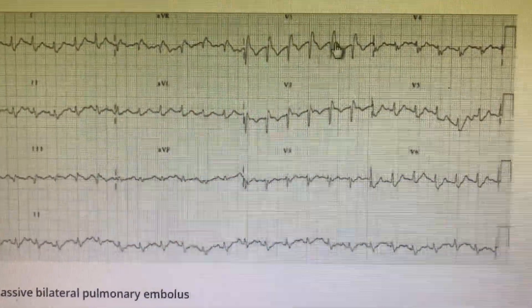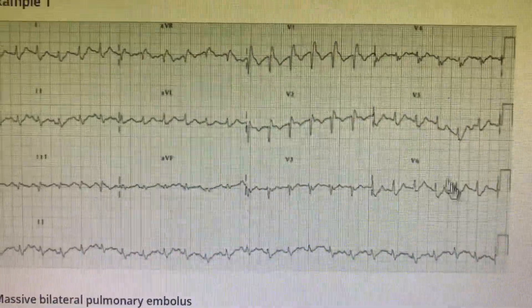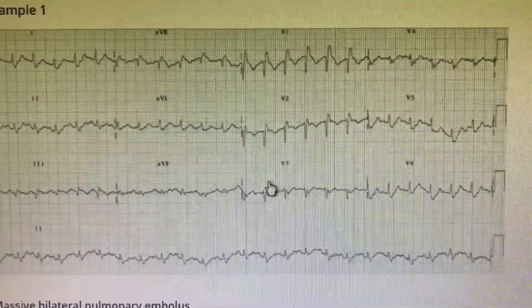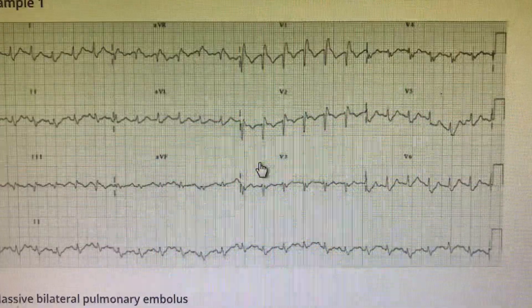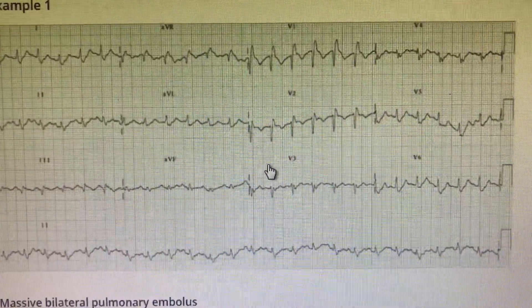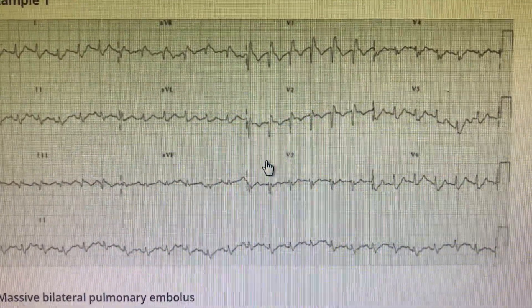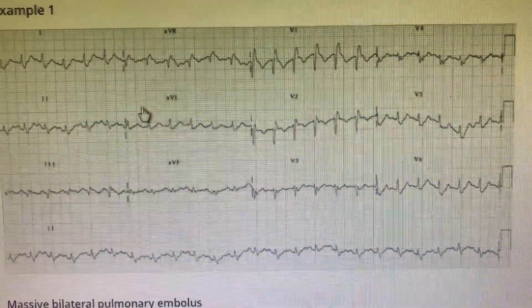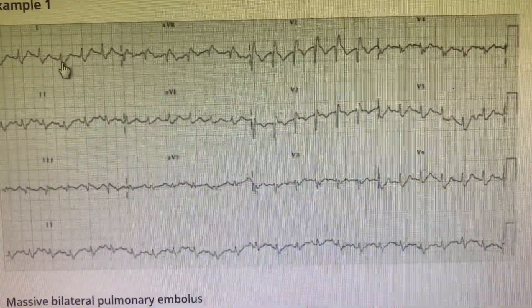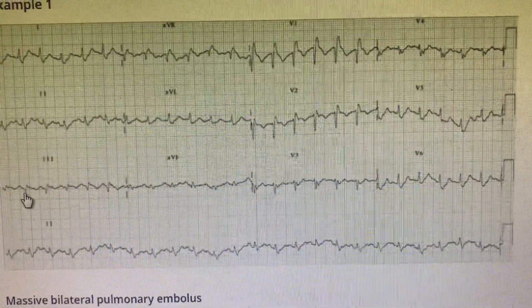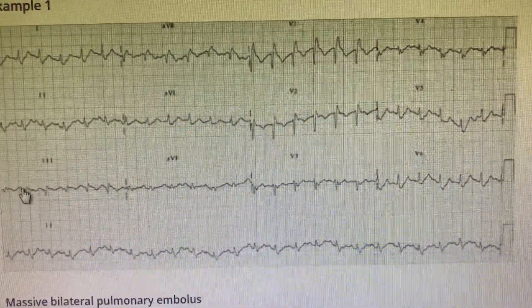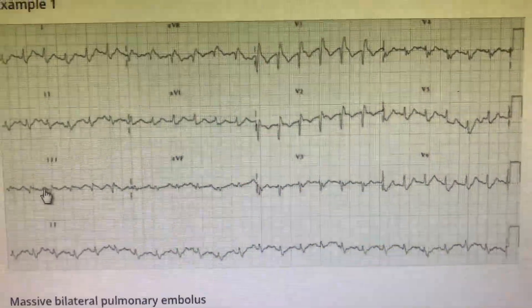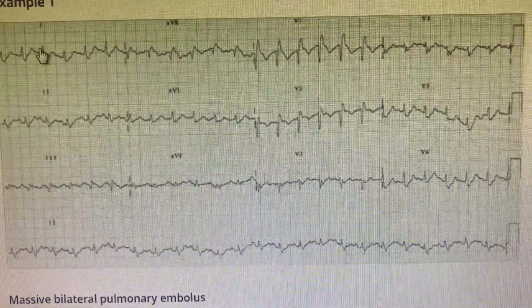The RV has become dilated and is compressing the LV, so the LV amplitudes are getting very less. You can see a huge decrease in the progression of R wave — there is reciprocal reversal of the R wave progression, and all voltages are very much less. Most ECGs will have slight modified variants of S1Q3T3 syndrome. There is a small Q compared to the prominent R, and there is a T wave inversion in lead 3 — S1, Q3, T3.